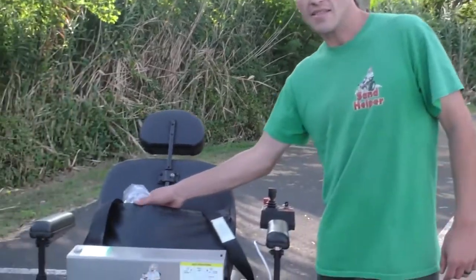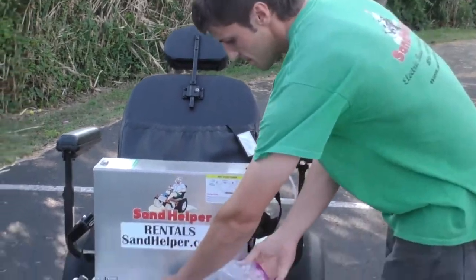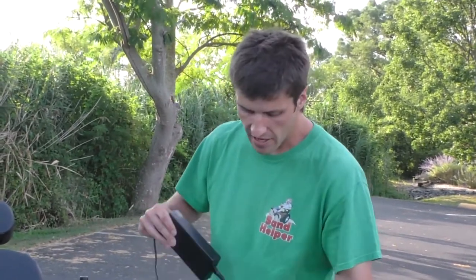The chargers are in the pocket behind the seat when we deliver the wheelchair, so you can get those out. You can either charge both batteries at the same time, or you could operate the chair on one battery while the other battery is inside charging.